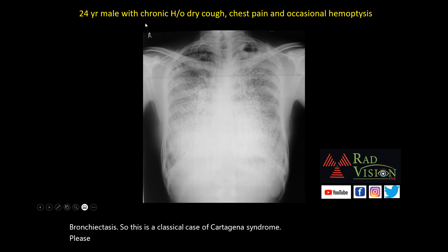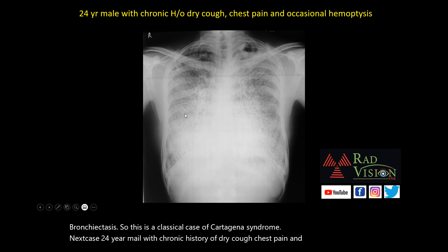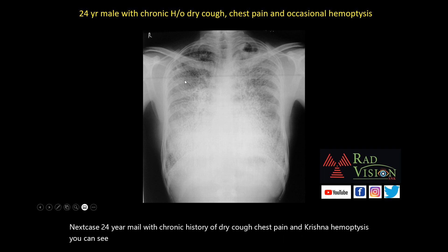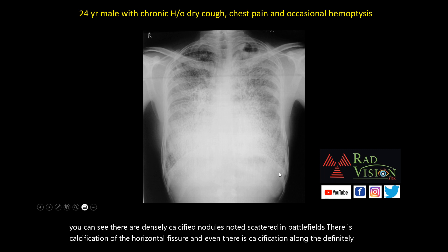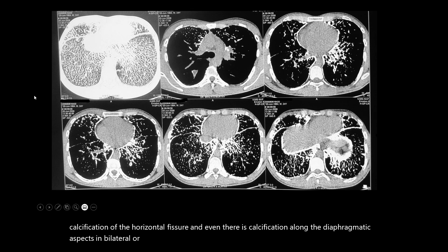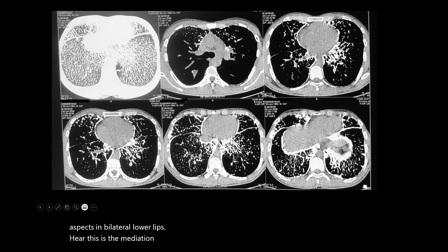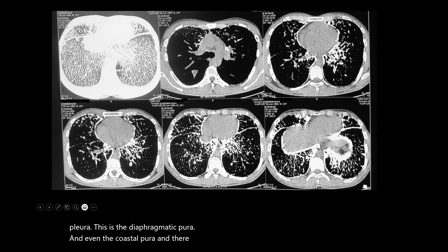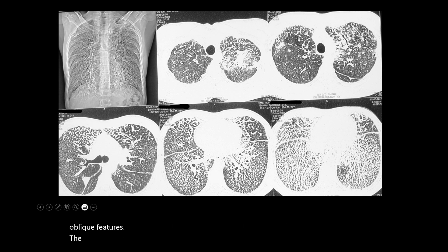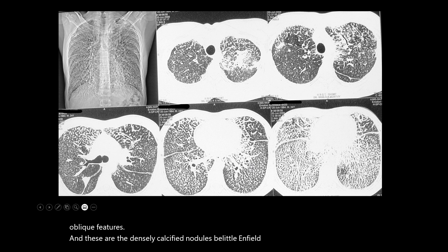Next case: A 24-year-old male with a chronic history of dry cough, chest pain, and occasional hemoptysis. You can see there are densely calcified nodules scattered in bilateral lung fields. There is calcification of the horizontal fissure and calcification along the diaphragmatic aspects in bilateral lower lobes. On the mediastinal window, there is a densely calcified pleura — mediastinal pleura, diaphragmatic pleura, and costal pleura — and calcification around the horizontal and oblique fissures.